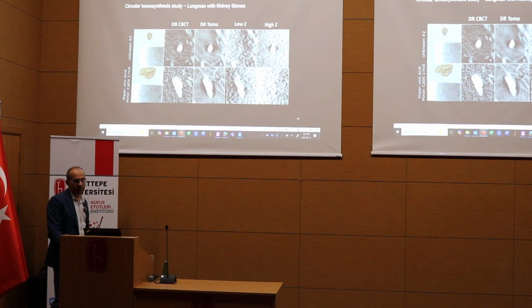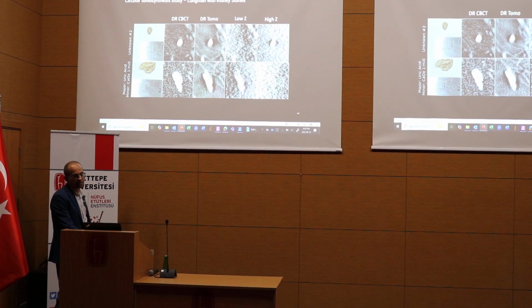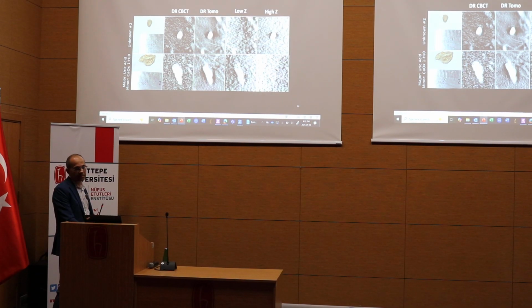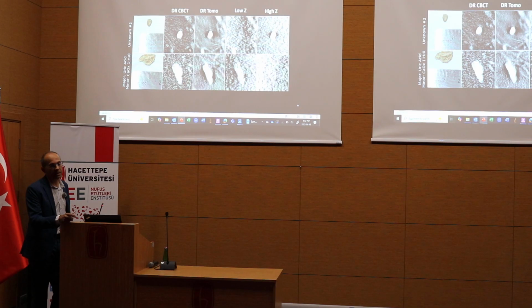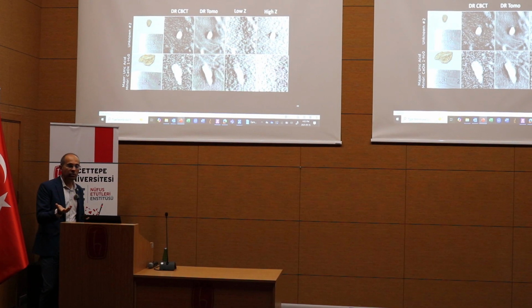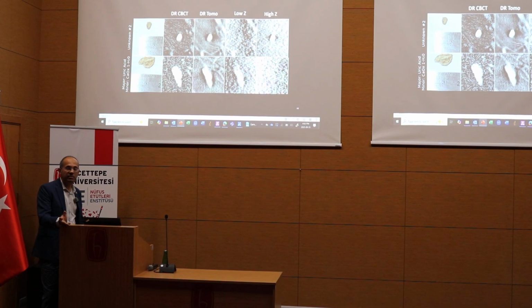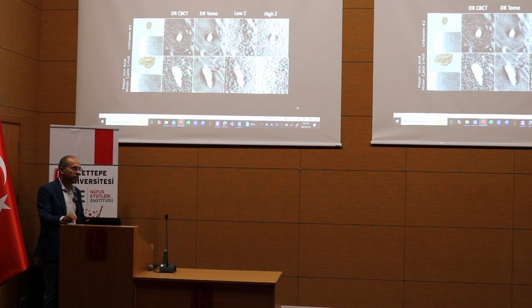This is a nice example from that same study. We were able to separate materials during the tomosynthesis. In this case, we were able to separate calcium from uric acid. We designed this specifically for a kidney stone application. Because in kidney stones, 80% are calcium stones and 20% roughly are uric acid. There's a few other esoteric varieties, but those are the two big ones.